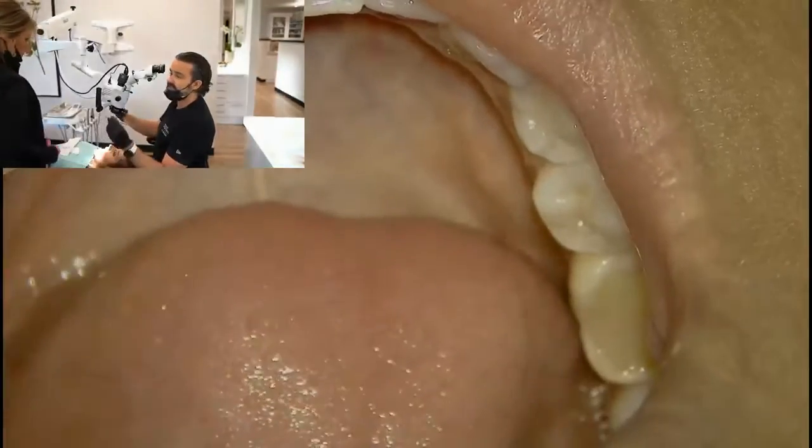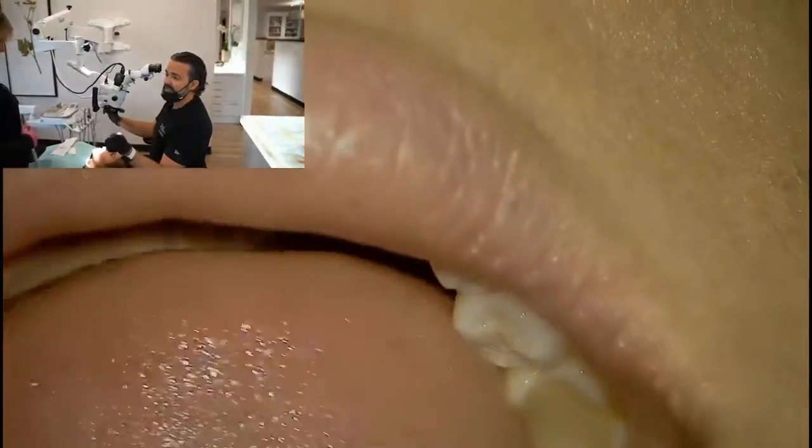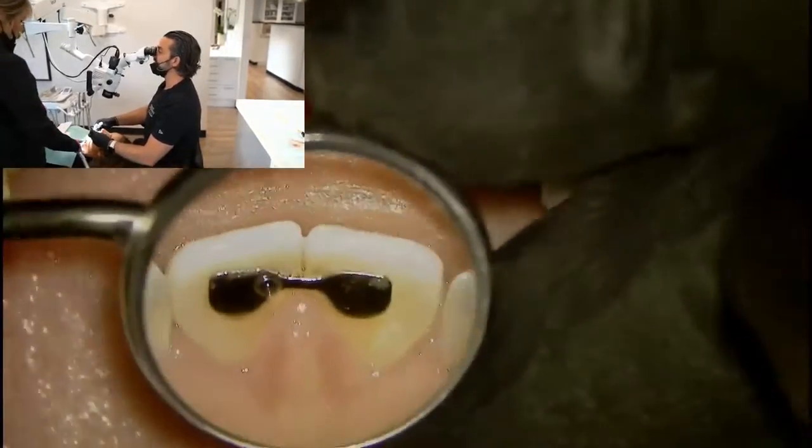And it's because you're working room to room, which speaks to how you use a microscope in your operatories. In my operatories, we work with microscopes in every room, and there are different doctors in each room. So there's a lot of tweaking that goes along with that.